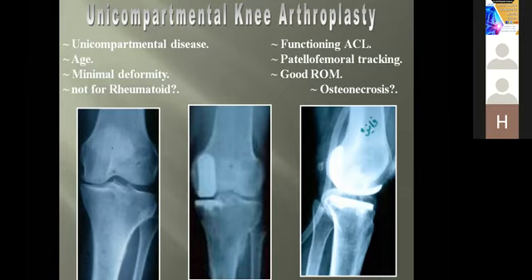The patellofemoral tracking should be good or accepted, and the patient should have good preoperative range of motion. Osteonecrosis is a debatable issue. Some surgeons say it's a good indication. Others say that the soft bone underlying your prosthesis makes your possibilities of success limited.